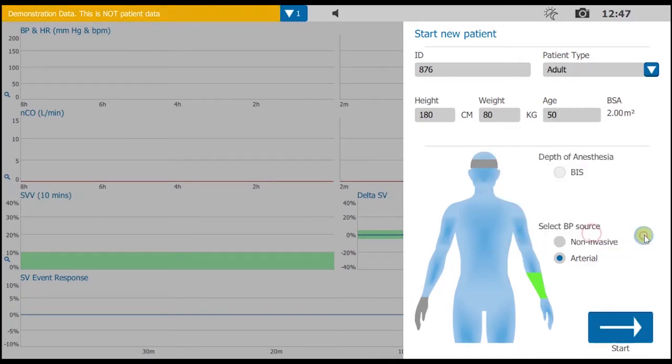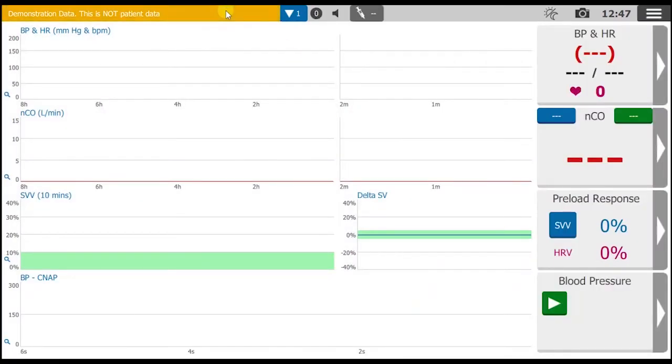Select non-invasive for BP source and you'll notice the green highlight moves to the hand of the mannequin. Press Start Monitoring and that'll take you to the Trends screen. Here the fourth channel is dedicated to the control of the finger cuffs, so press the green icon with the arrow to begin the signal acquisition process.